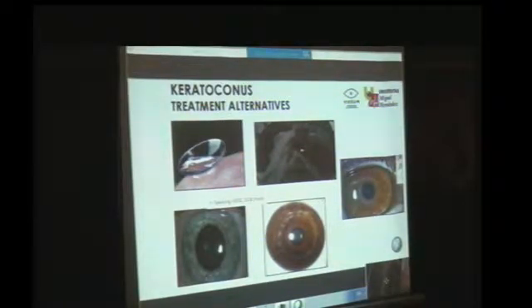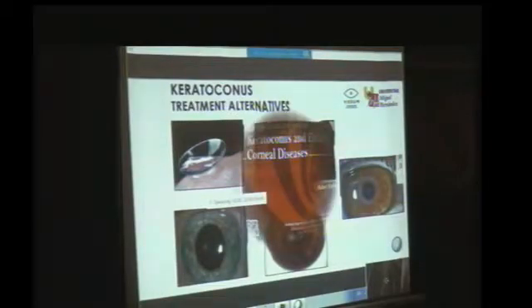Corneal graft has been greatly improved by the use of deep anterior lamellar techniques, which are many times assisted by femtosecond laser. Dr. Ahmed Al-Bahrani has made a study like this with us, and indeed we have good technology to use today in these cases. But in any case, all these therapies try to solve a problem that already exists. The tissue is a diseased tissue and is modified, partially restoring the geometry by these treatments.